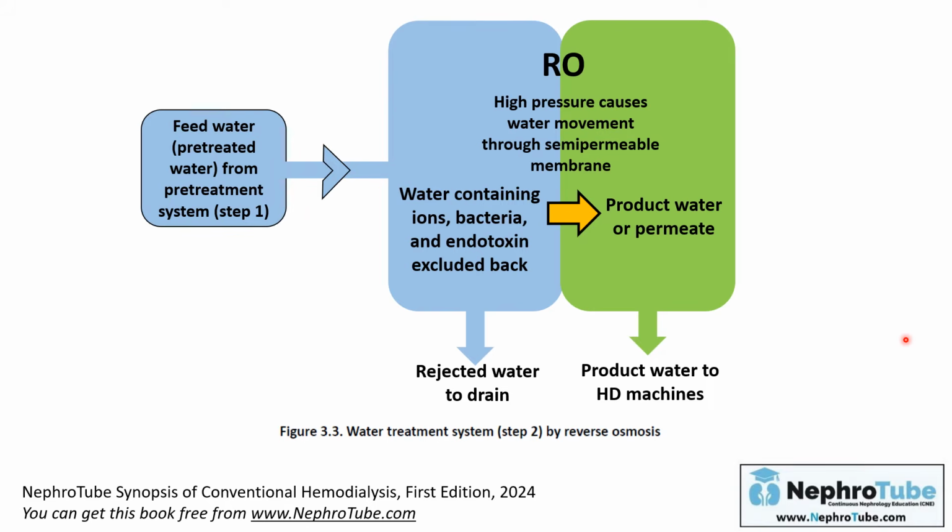They can use two ROs, a two-stage RO or double RO, to reach the standard quality of the feed water.